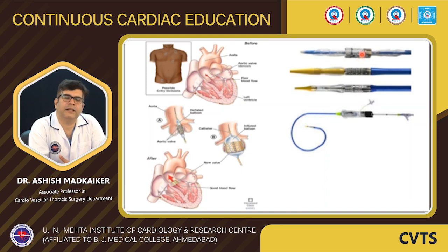Then these are the delivery devices which already have the valve seated on them. With this delivery device, we need to place it in the best position. This is the position where it is across the aortic valve, and we should confirm this again with multiple views and TOE. And then once we are sure about the positioning, we need to deploy these valves. Some of them are balloon deployed, some of them are self-deployable. So depending on what it is, we deploy the valve, and the valve seats here and the problem is over.